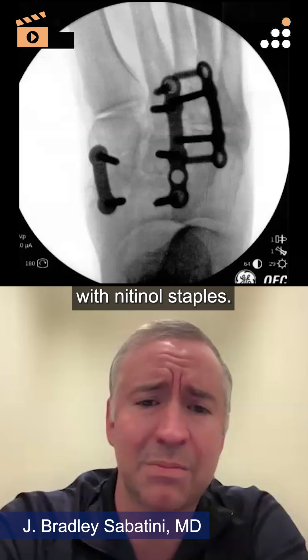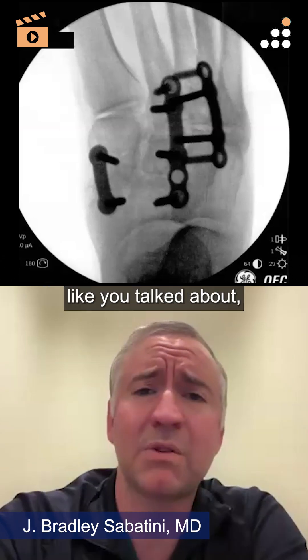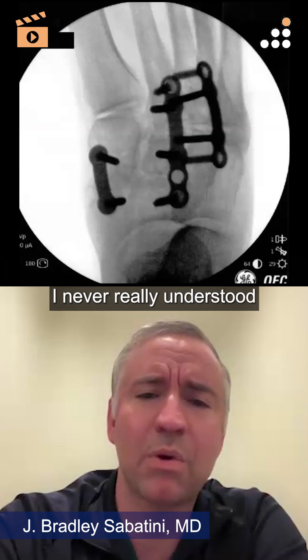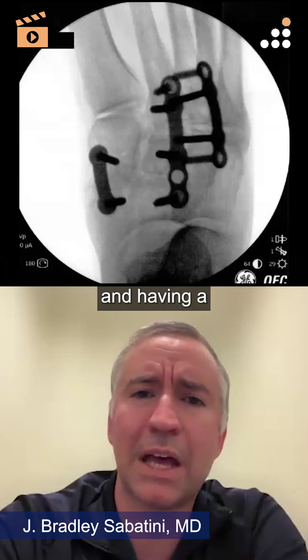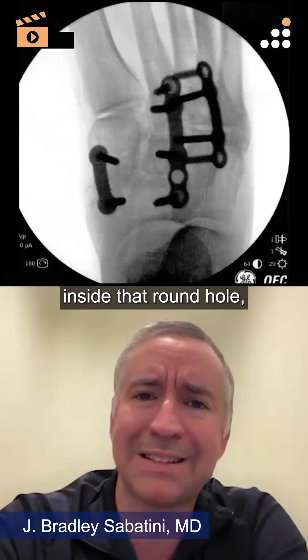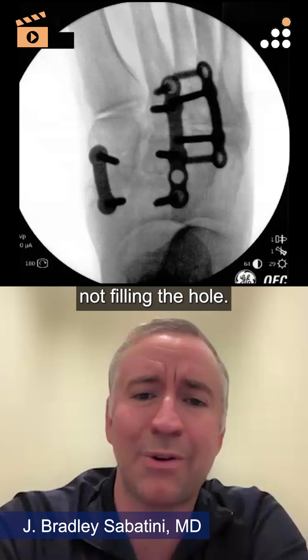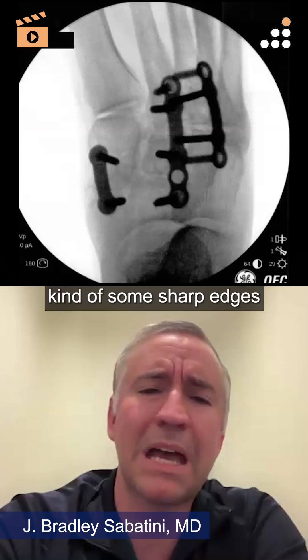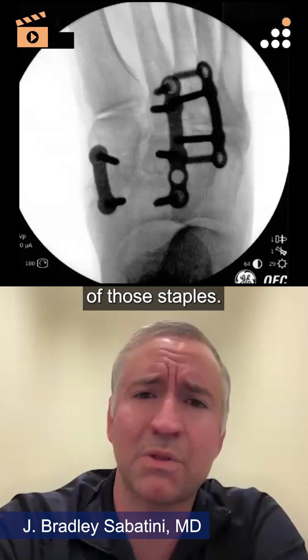But there are some pitfalls with nitinol staples. Specifically, you've got kind of a narrow bridge. I never really understood having a round hole and having a small square peg inside that round hole not filling the hole, and not only that, you would sometimes have kind of some sharp edges on the edges of those staples.